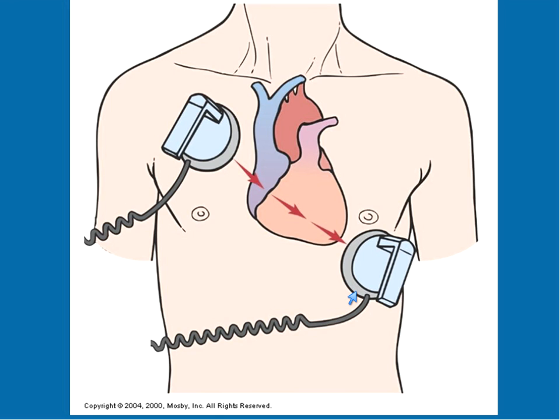Always call all clear before you push that button, and not just call all clear, but do a visual check to make sure that indeed nobody's touching the bed or the patient. More concepts coming.